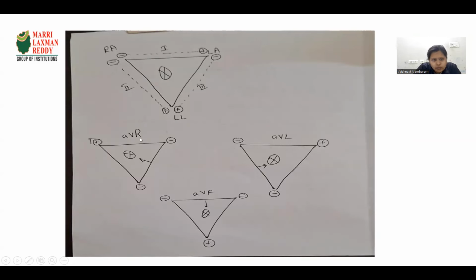Here this is augmented vector right, so it is exactly opposite of lead 2 because of the placement of positive electrodes. So in the augmented vector right, you have inverted P waves. The R wave is also inverted, and the S wave is having a positive deflection. That is exactly opposite of your lead 2. The graph looks like that.